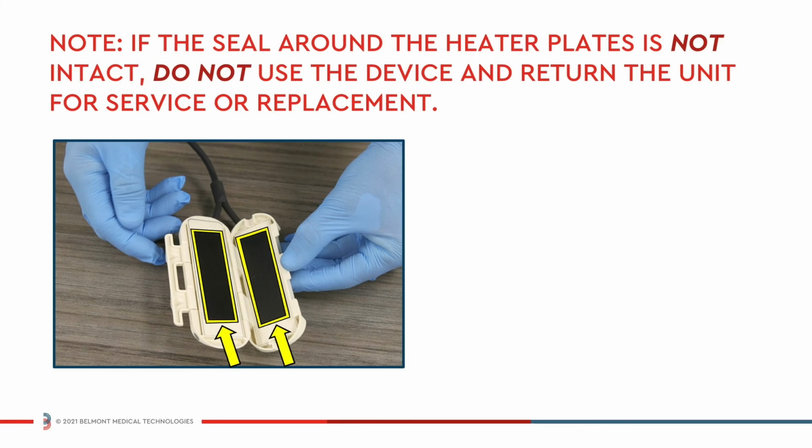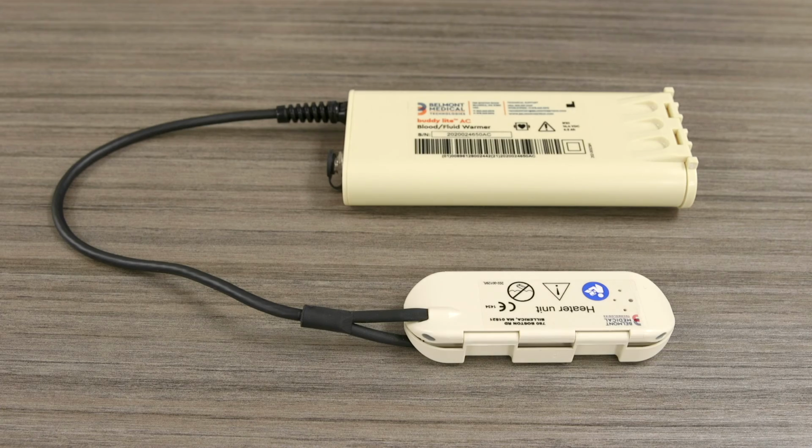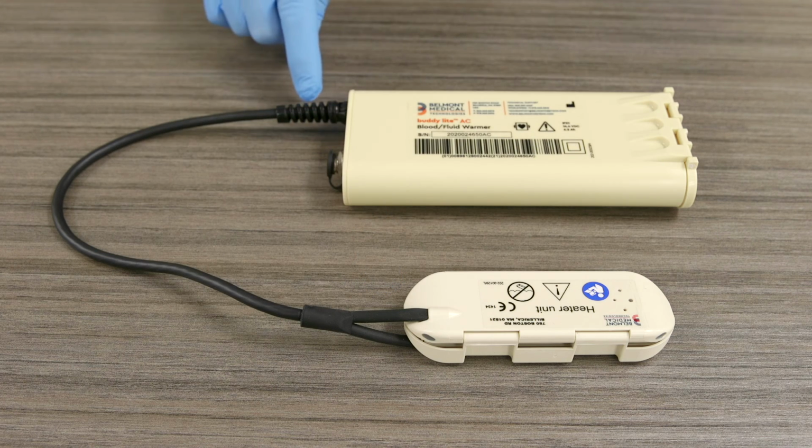Note, if the seal around the heater plates is not intact, do not use the device and return the unit for service or replacement. Once the unit is cleaned, visually inspect the wiring and connections for fraying or worn wiring. If any of the connections or wiring are damaged, do not use the device and return the unit for service.